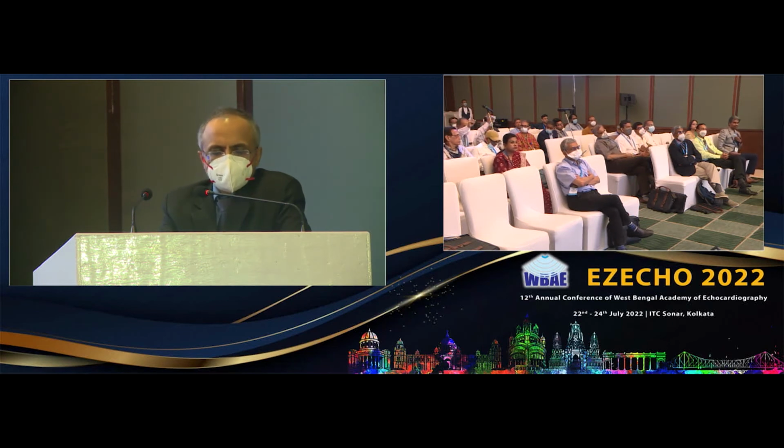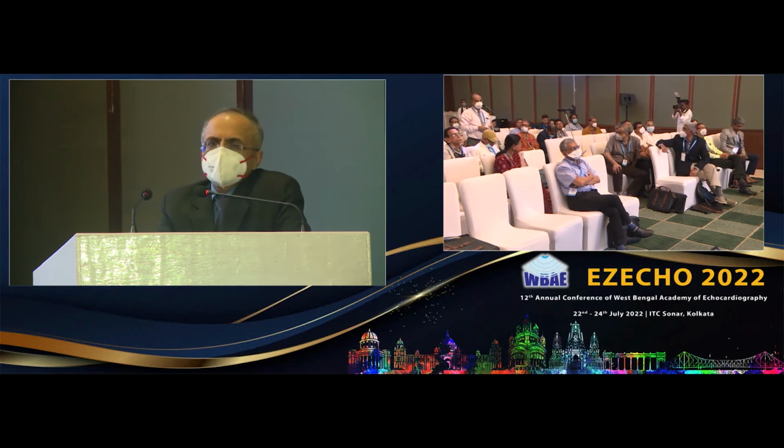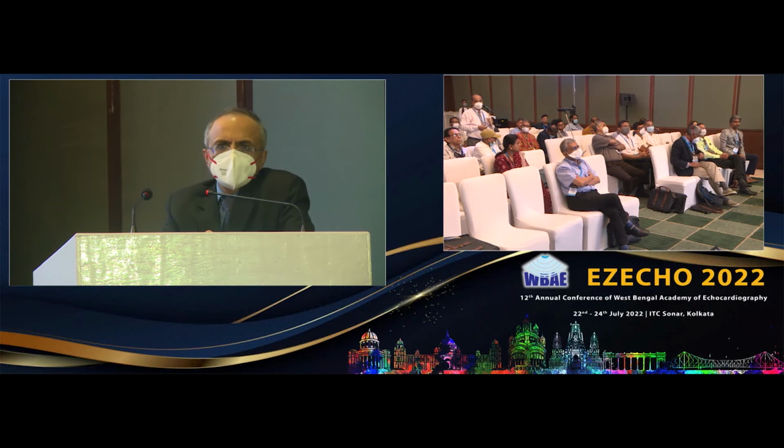In fact, MR is a very good modality. If you please don't mind, I have got a young footballer who comes routinely for a checkup. Blood pressure is normal. He is asymptomatic. His ECG shows LVH. I do an echocardiography and find a concentric LVH, 15 to 16 millimeters. Now there is an issue. Do I suggest a CMR, or how do we advise him whether he should continue playing or restrict? Can you give me a suggestion?